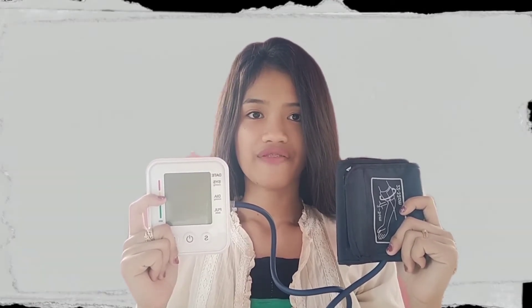Digital blood pressure monitors are battery-operated and consist of a case with an on/off switch, a start button, and in some machines a print switch and a memory box. The digital blood pressure monitor is a device for self-testing, intended to be used by a person in a home environment.